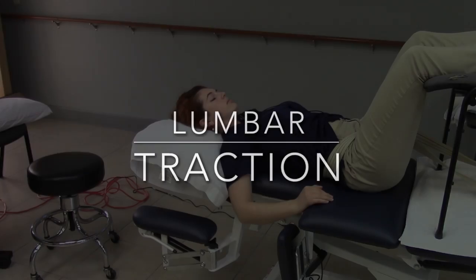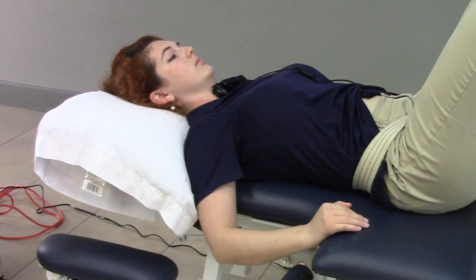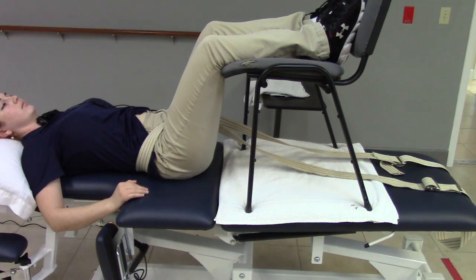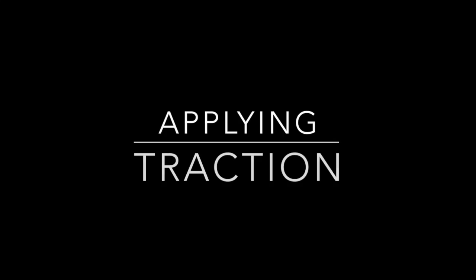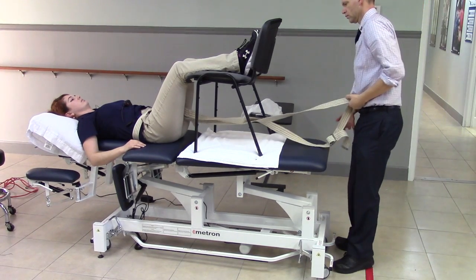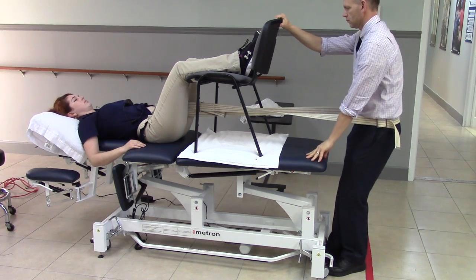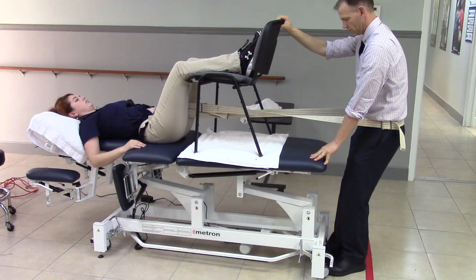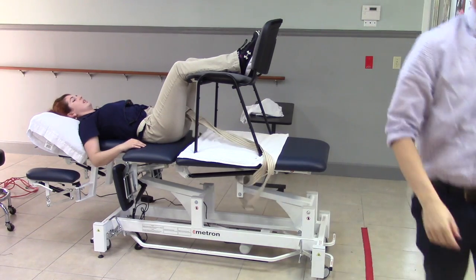You can perform lumbar traction using this table. Put the sectionals down so the guest can rest their hands in the lower region of the table. Place a gait belt around their waist, through the center of their legs, with a chair on the table — note the towel to protect the vinyl. Apply traction by stepping to the back of the table with the gait belt around the waist and gently leaning back, creating distraction to the lumbar region.